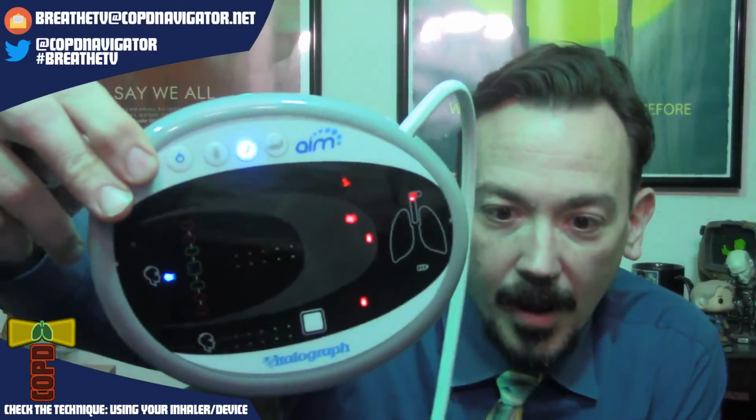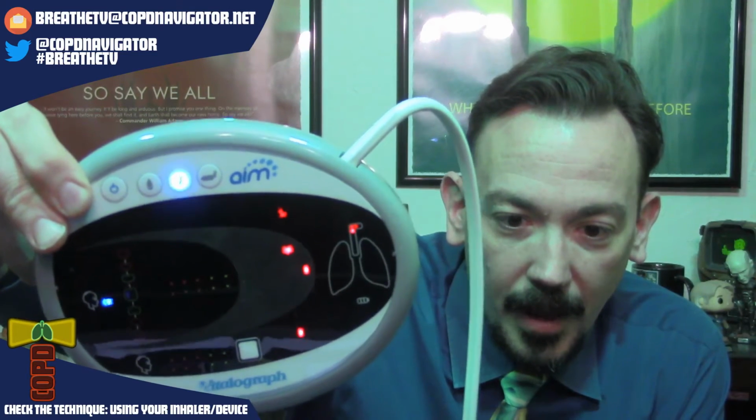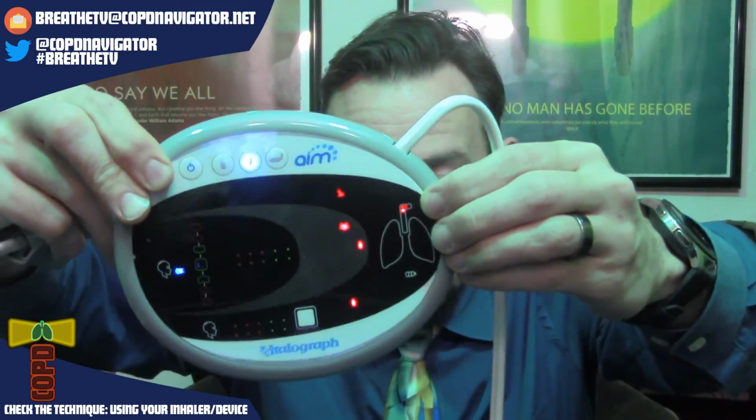We can see on our nice little graph here, we see red lights for coordination. We see a red light for flow, a red light for inspiratory time, and a red light for breath hold. All of these things are problematic, and we see over here on the diagram that most of the medication is probably getting to the back of the throat, and that's about it.